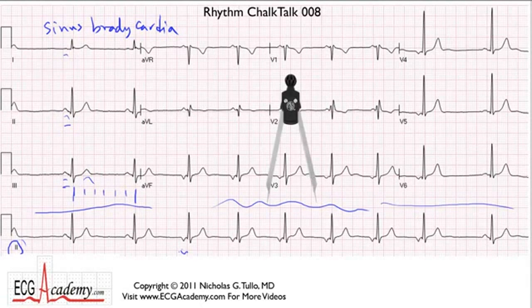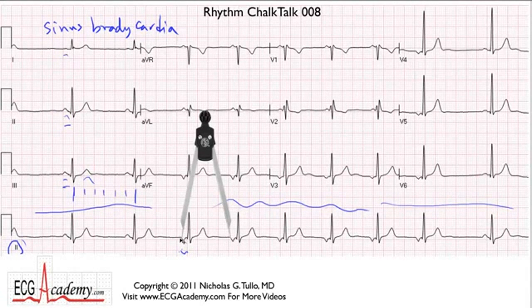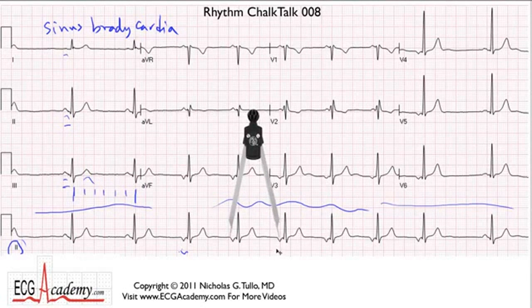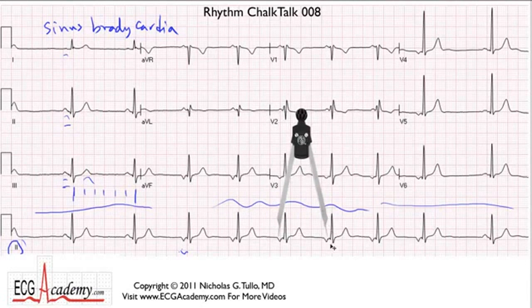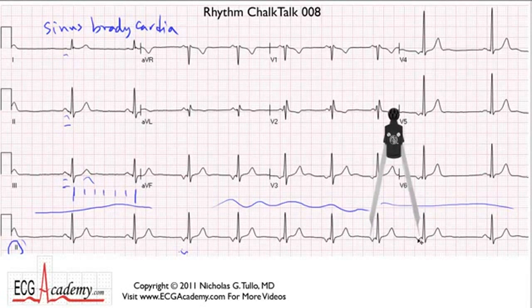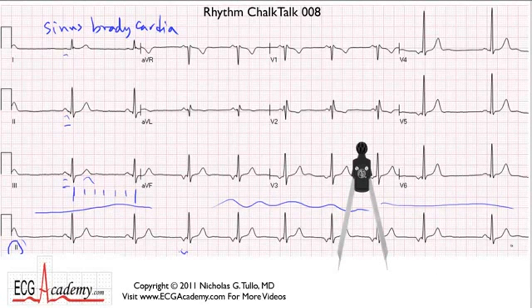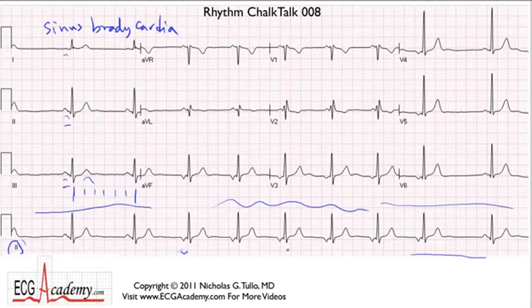Taking another pair of calipers set for the P-to-P interval — counting back, that's about 300, 150, 175, 60, maybe 66 beats per minute — you can see the next P-to-P interval actually speeds up a little. The rhythm kind of warms up, going from 66 to maybe 72 beats per minute. Then after the last beat, it stops and the normal P wave comes in after a bit of a pause.